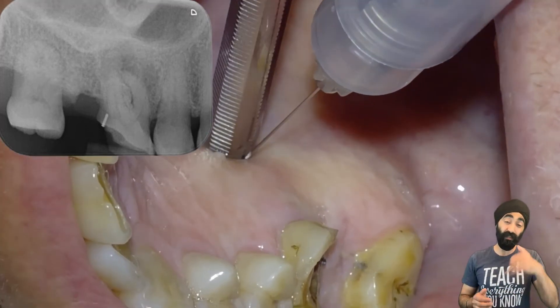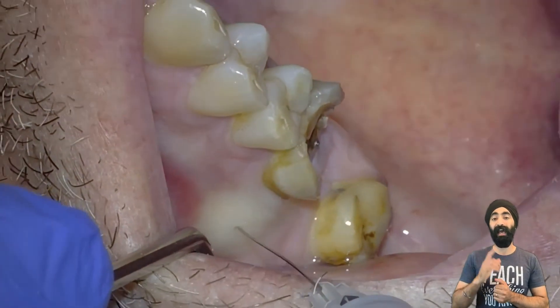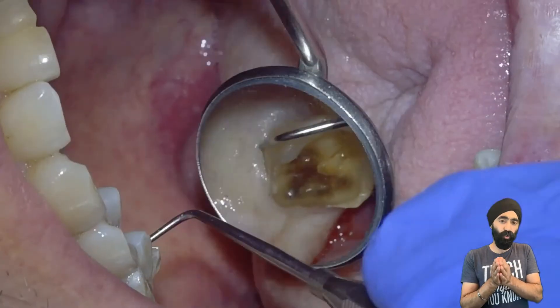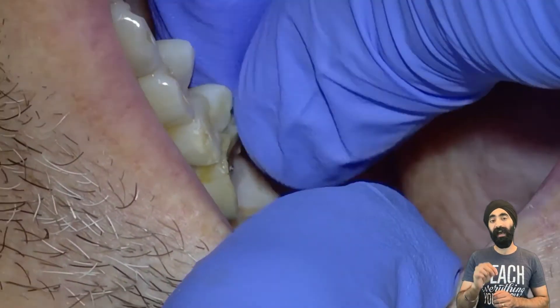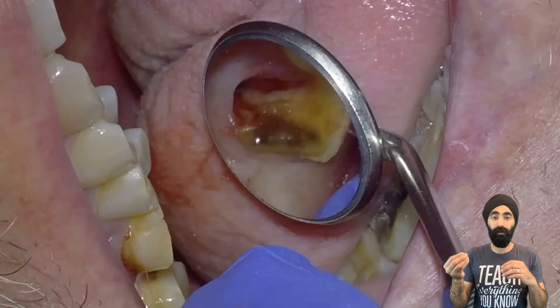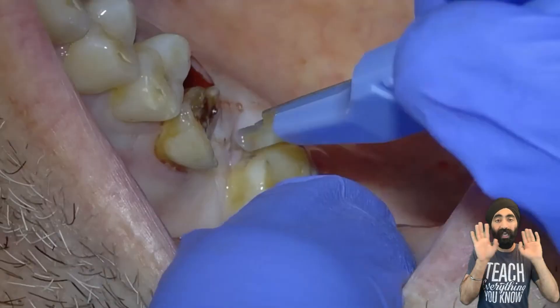After I gave anesthesia, that's me pressing with the handle of my mirror to reduce how much the patient feels from this extraction. And remember, there was a bit of infection in that area — you might have noticed a radiolucency — so whenever I have an infection, I do put some anesthetic in that region. This is me now checking for anesthesia. There was a loose fragment; the tooth is cracked. So before I start my extraction, I'm actually removing the loose fragment because I don't want that to get inhaled or swallowed. So anything loose, I get rid of first.